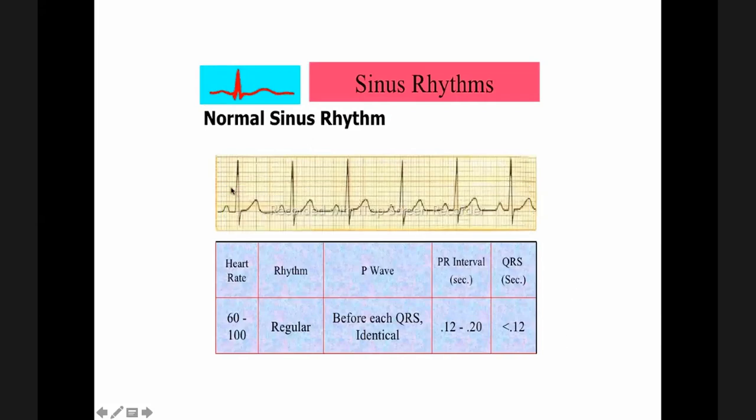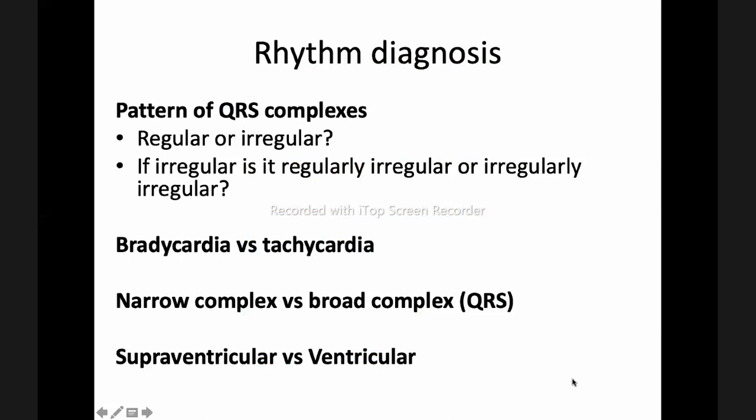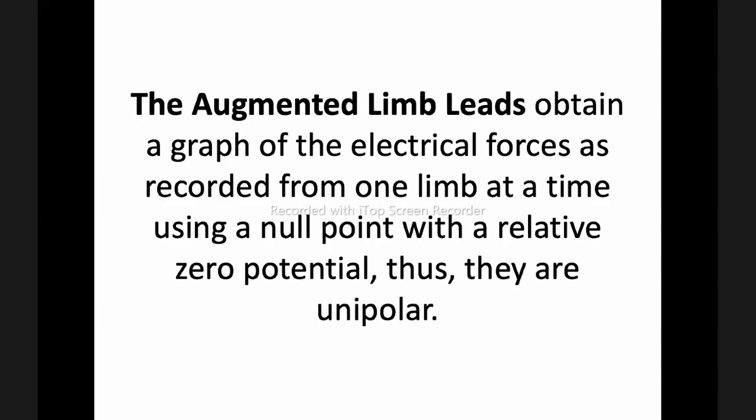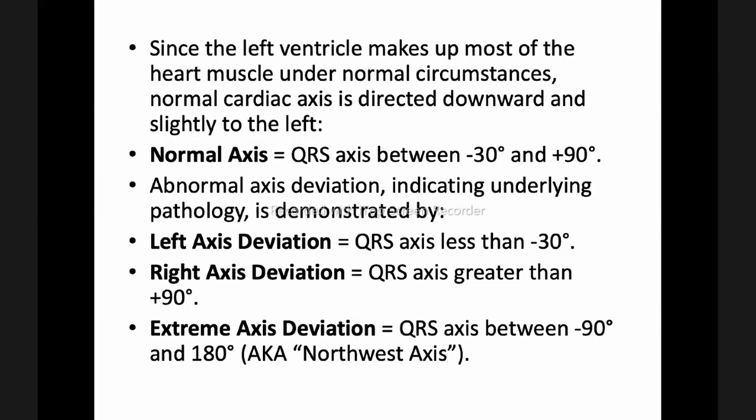And by the way, for simplicity's sake, I only took lead two. So this is lead two, okay? I won't go into cardiac axis. This is all the things that I used to teach.